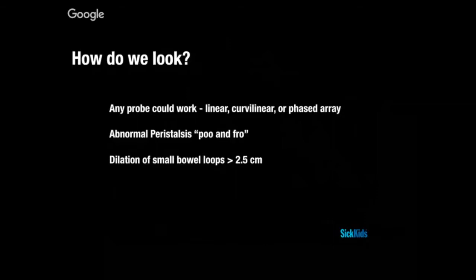We see abnormal peristalsis, which we call to-and-fro — movement back and forth because peristalsis is pushing against a stationary obstruction. We also look for dilation of the small bowel; in adults, greater than two and a half centimeters is the threshold considered most sensitive for SBO. If you want to differentiate jejunal from ileal obstruction, the jejunum typically has more prominent and numerous valvulae conniventes, whereas the ileum lacks those folds.